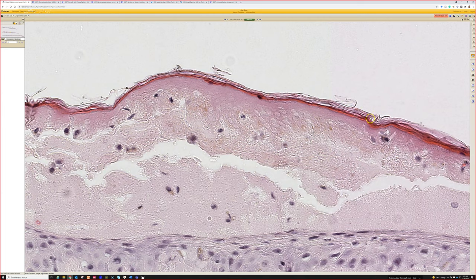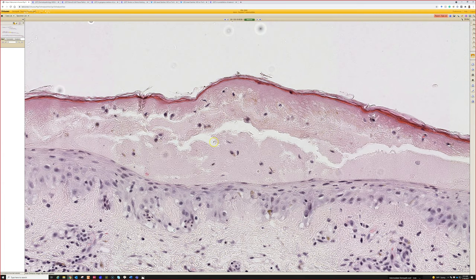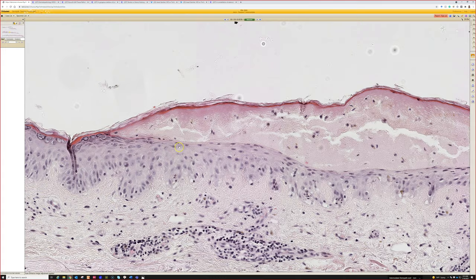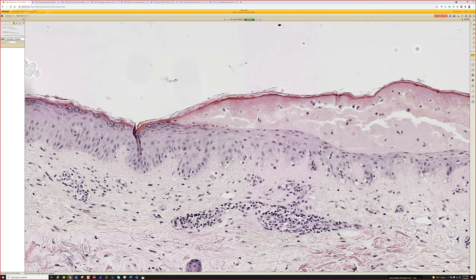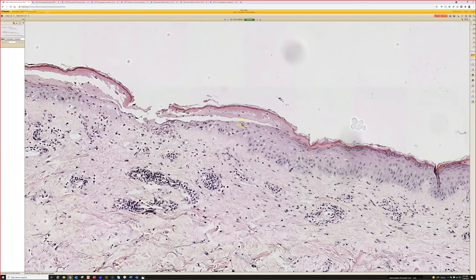Several things can cause that. Burn — which is what this is, actually a curling iron burn. Freeze artifact from cryo — to me, cryo and burn look essentially identical: a wiped-out zone of death in the epidermis. They look like thermal injury — either too much heat or too little heat can cause this disappearance. Also some blistering diseases: when the blister has been present long enough, the roof can die, and you can re-epithelialize. Then acute ischemia can cause sudden death of the epidermis.